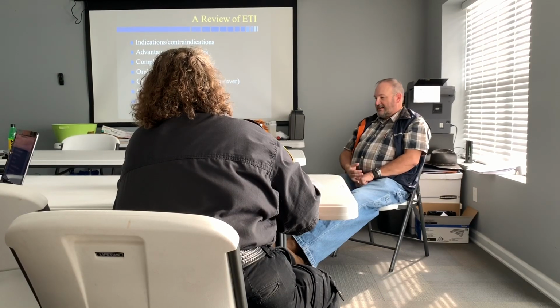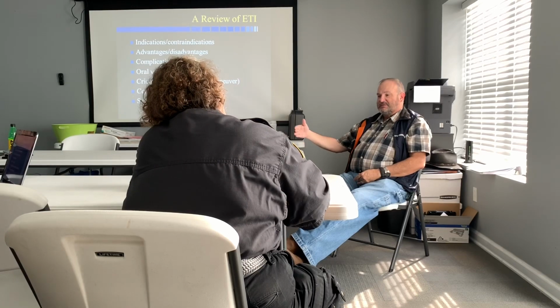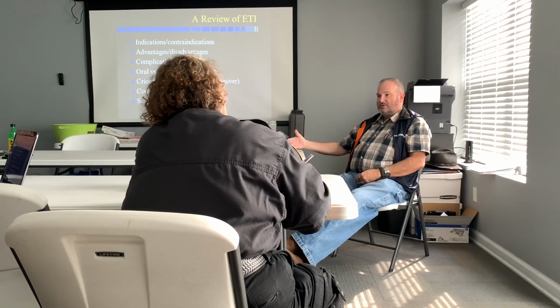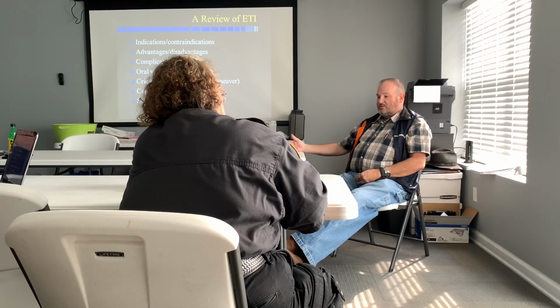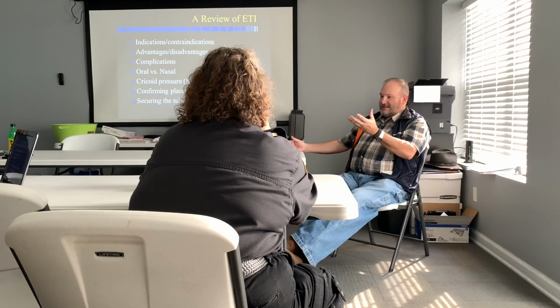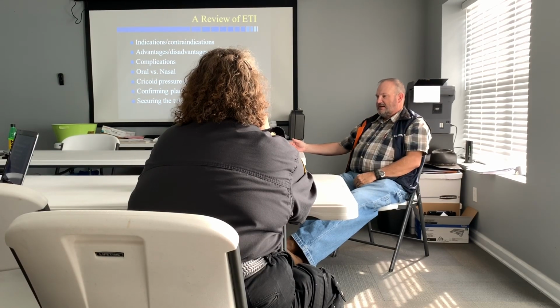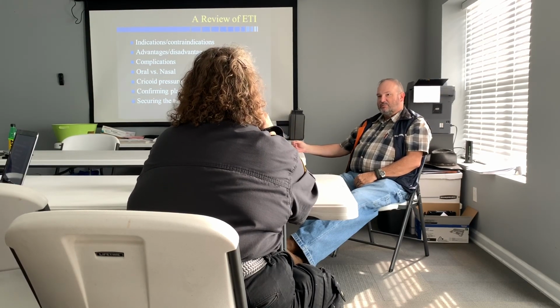Waveform capnography is the gold standard these days. Of all the new toys I've seen come down the pipe, probably the one with the most impact I've seen to date is waveform capnography. Because A, it gives you an idea that your tube is in place, but B, it also gives you an idea that you're perfusing. But the biggest thing is it gives you a very good look into one of the two major parameters that cause acid-base balance in your body, right?